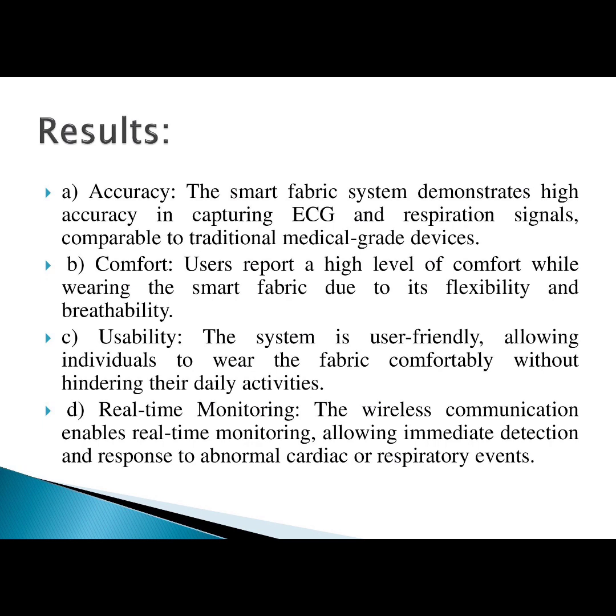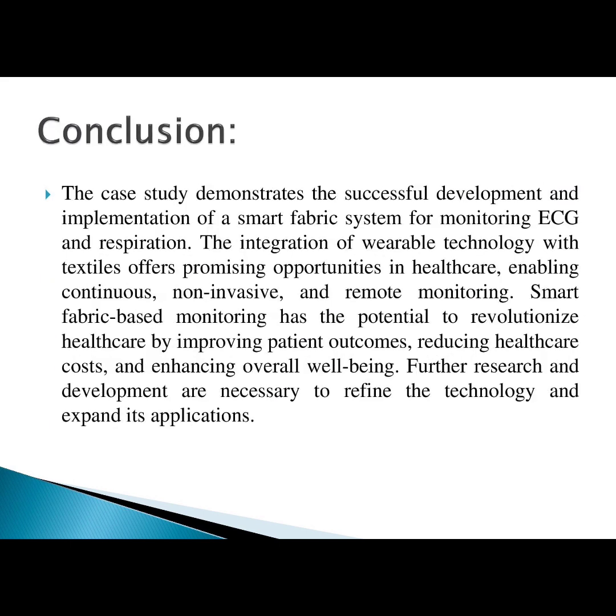Real time monitoring. The wireless communication enables real time monitoring, allowing immediate detection and response to abnormal cardiac or respiratory events. Conclusion. The case study demonstrates the successful development and implementation of a smart fabric system for monitoring ECG and respiration.